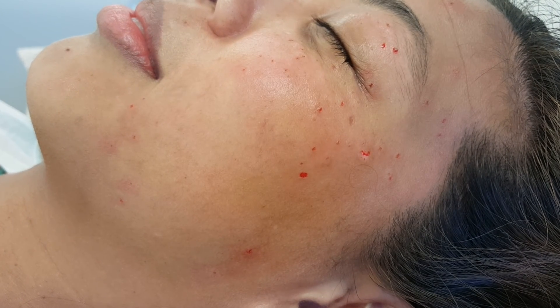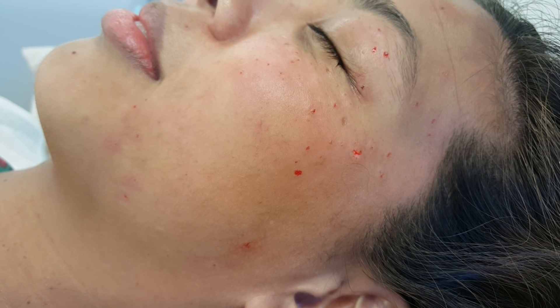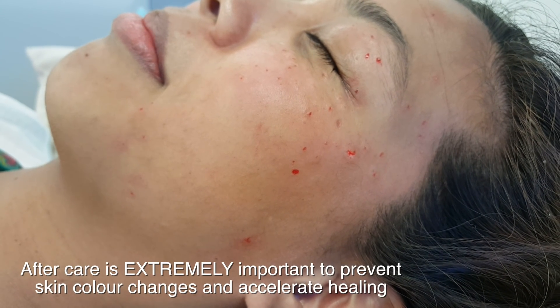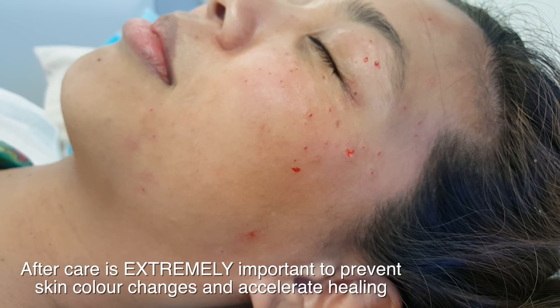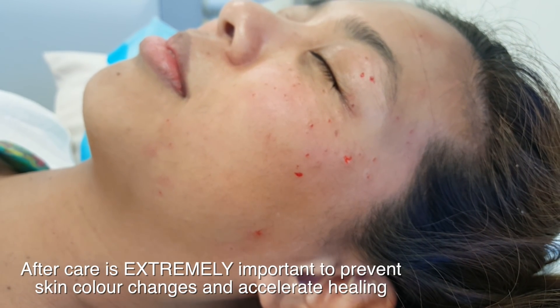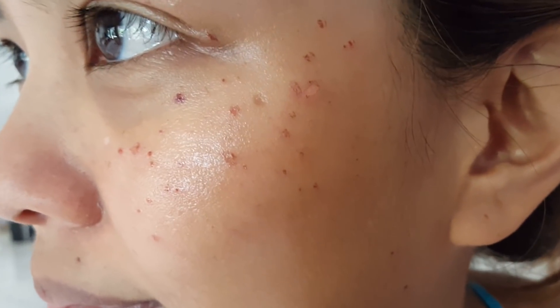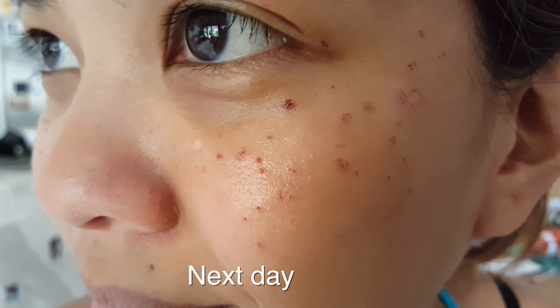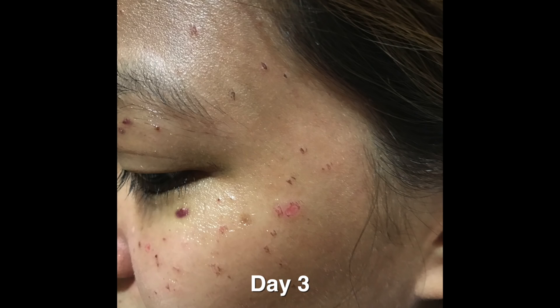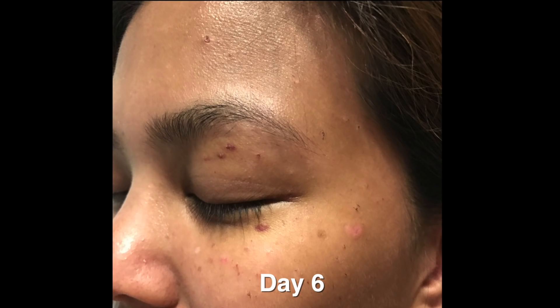This is what she looks like post-operatively, directly after the laser and curette session. There are pinpoint areas of bleeding that will heal up tonight. We're going to apply a steroid together with an antibacterial ointment. The next day it's really important to keep the moisturizer and antibacterial on. By day three healing is progressing, and at day six she's almost completely healed.